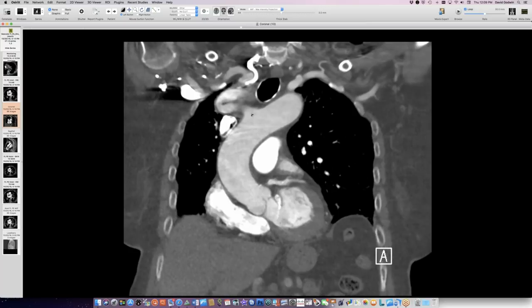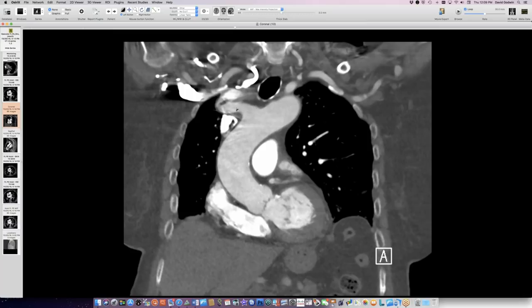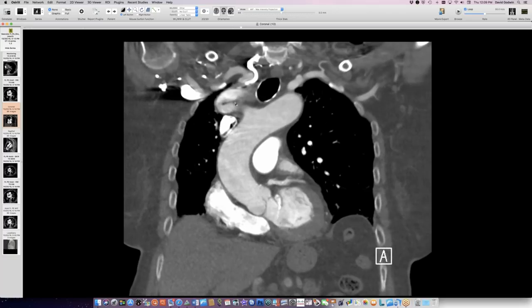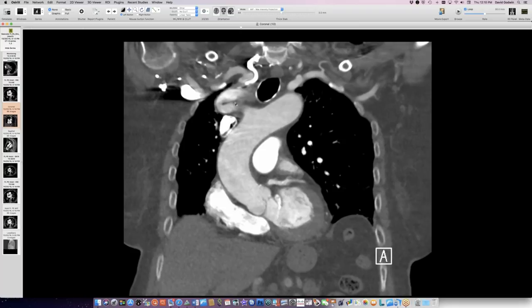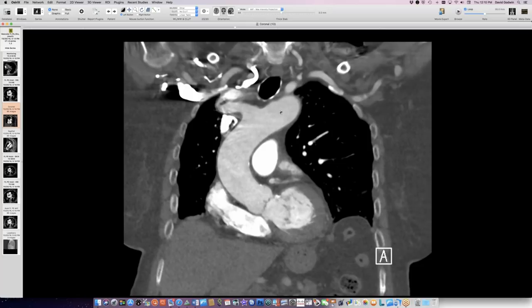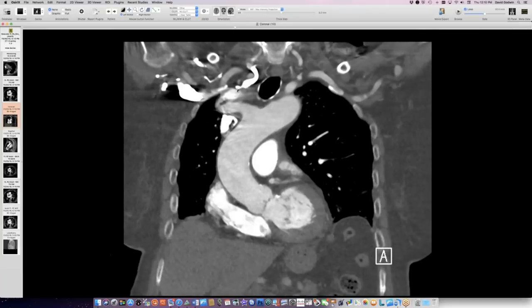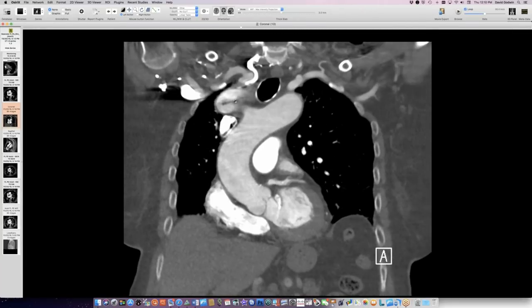It looks enough like a mass to confuse you. But this is a really extreme example where this buckling makes it look more like a lung lesion — I thought this was a lung tumor, not a mediastinal tumor, but it's a pseudotumor. It's this right brachiocephalic artery misbehaving. The typical right brachiocephalic artery pseudotumor is in an older person whose aorta is elongated and the arch is elevated, pushing up the floor under the right brachiocephalic artery and forcing it to buckle. The vessel also becomes tortuous with age. This is extreme mediastinal widening, so much so that it looks like a lung lesion. So: right brachiocephalic artery pseudotumor.